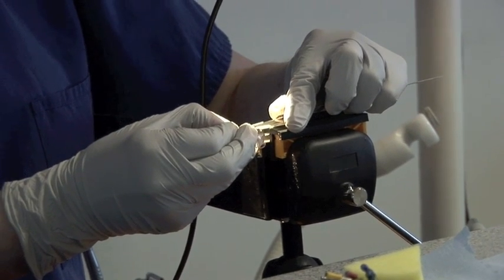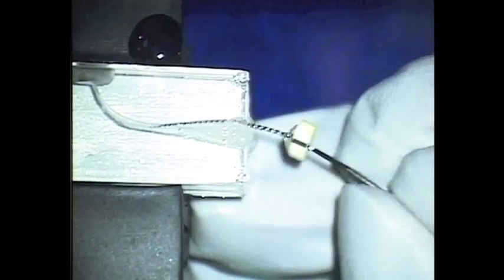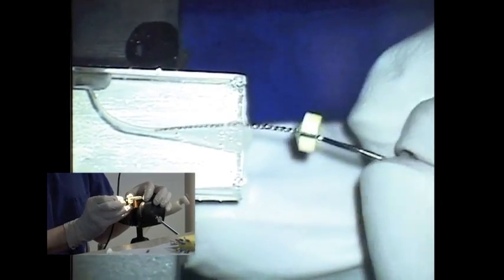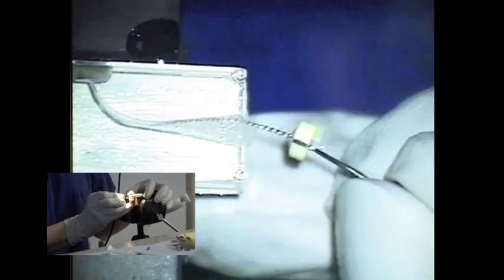Pick up a smaller size file such as a size 20 at about 15 millimetres to try and smooth off the preparation. You can do some circumferential filing to smooth off the taper — just all the way around the walls, very very carefully, with very small amplitude filing, just to finish it off.